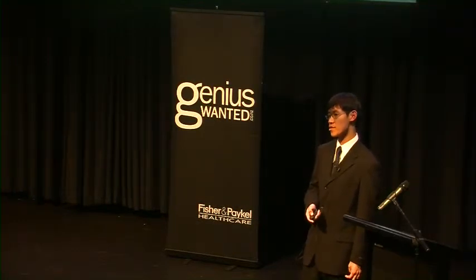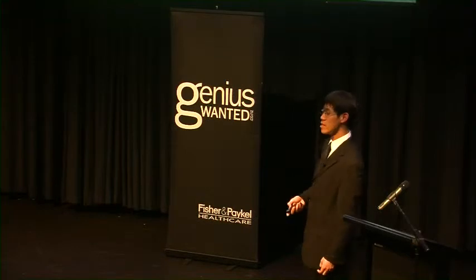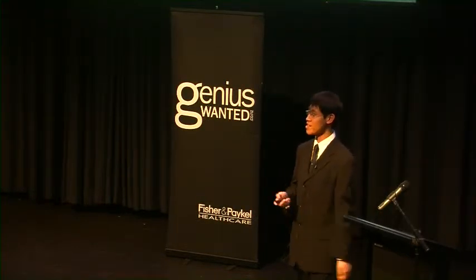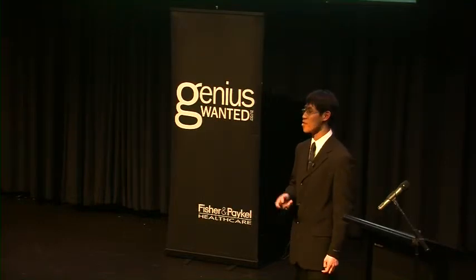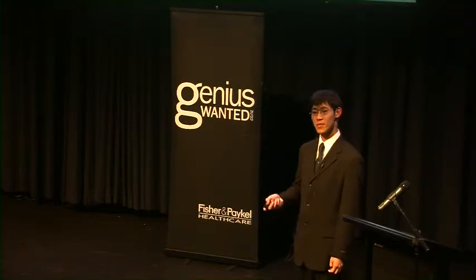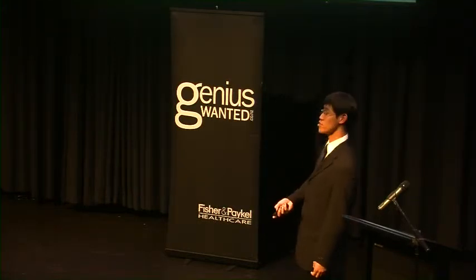The answer is because of eddy currents. Eddy currents are electric currents that get induced inside the scanner as a result of the scanner's rapidly changing magnetic field. It's basically the same idea behind how electric generators generate electricity. During an MRI scan, the magnetic field inside the scanner changes rapidly. It pulses up and down.